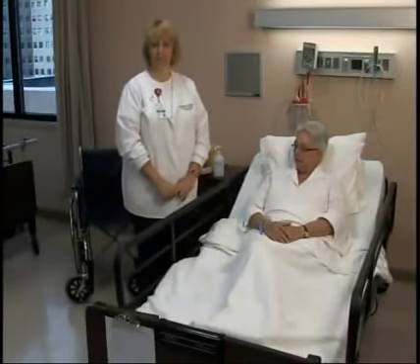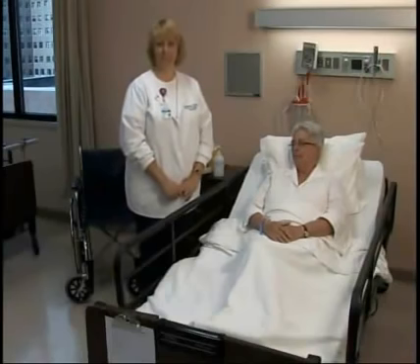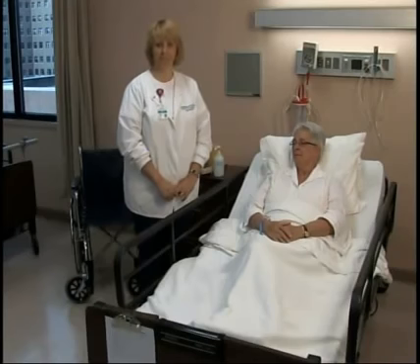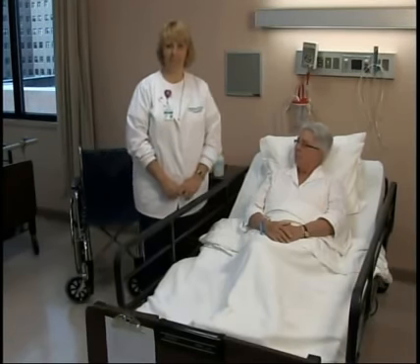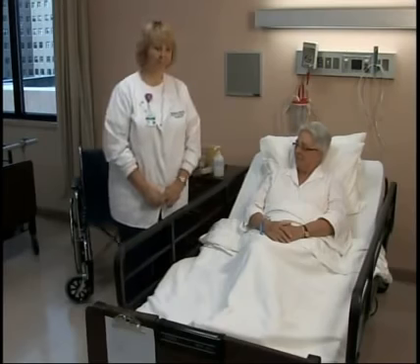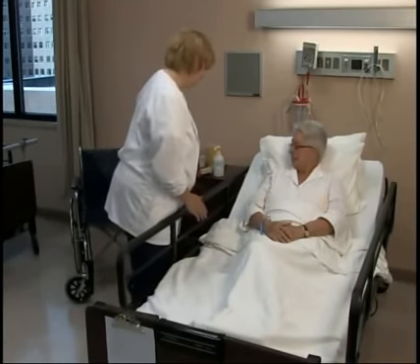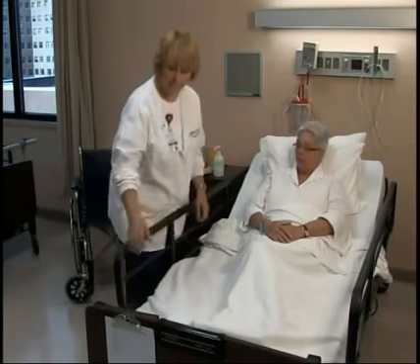The following is a demonstration of the validation skill transfer from bed to chair and bed to stretcher. First, bed to chair. Wash your hands before entering the patient's room. Introduce yourself to your patient and explain that you will be getting them out of bed to the chair.